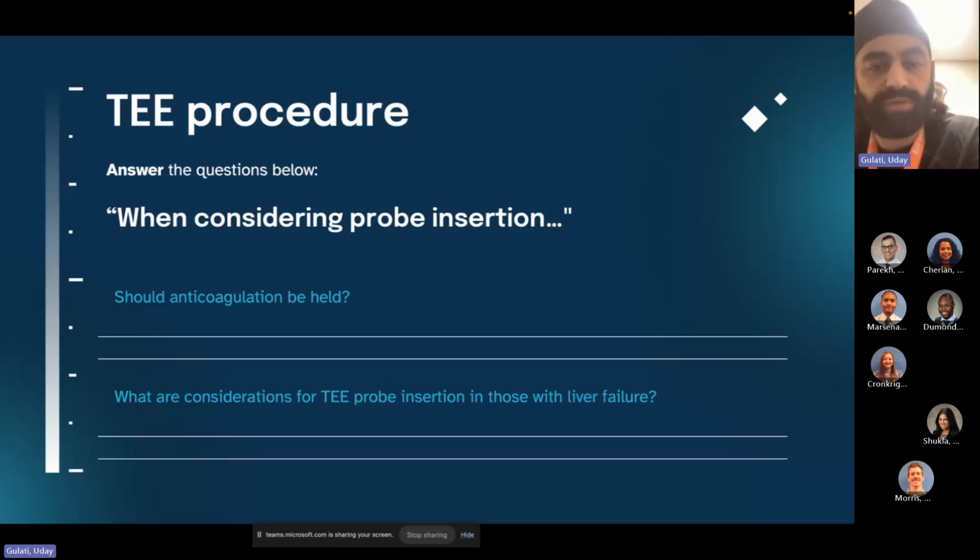Well, think about it this way. You have a patient who's going in for DC cardioversion. They're going to get a TEE right before the procedure. They've had heparin continued pretty much until that standpoint, because they're concerned about risk of embolus. They still insert the TEE probe. And some of the videos that I watched, lectures by intensivists that practice this and teach this routinely with their group, they will even consider doing it on a patient in triple therapy because the bleeding risk is just so low.